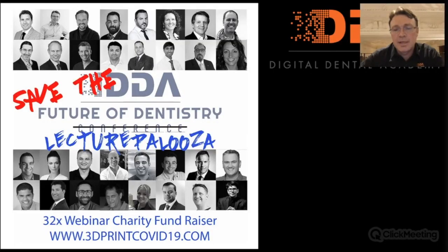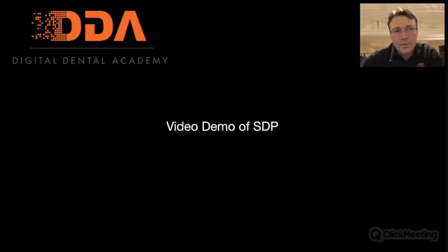So yeah, it really helps to just get that. Firstly, get your patient involved and let the patient see if they would like something like that. When I do the export, I send quite a big disclaimer with the email, so that the patients know this is just an animation of what it probably will look like. It's not a definitive final proposal. But it gives them a good idea of how it will look when you correct the harmony and the aesthetics.